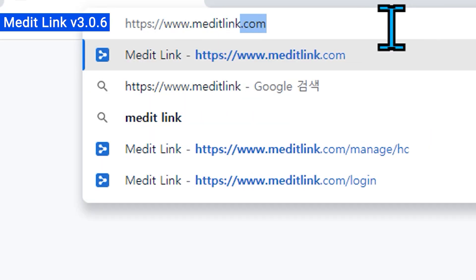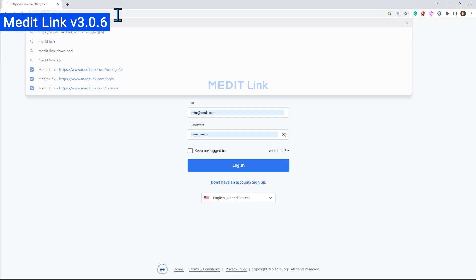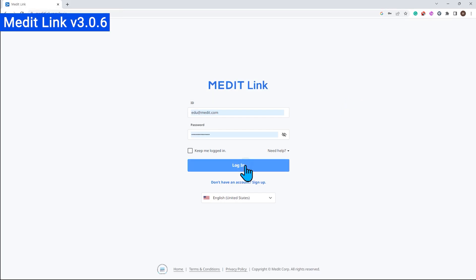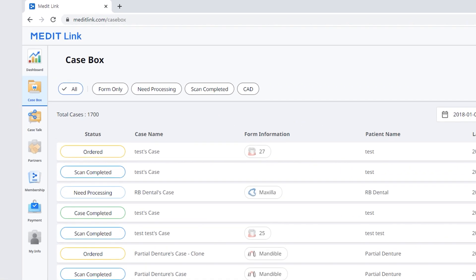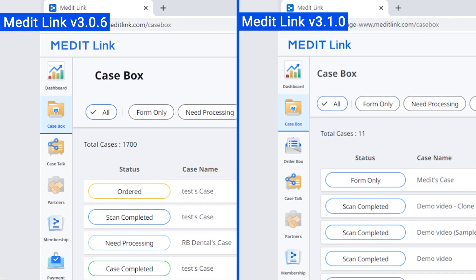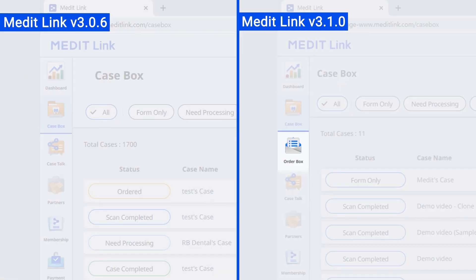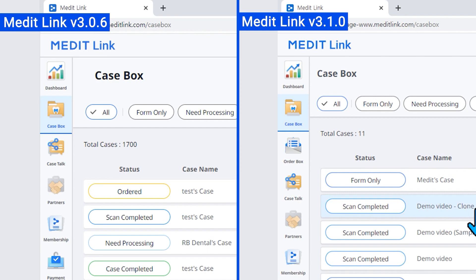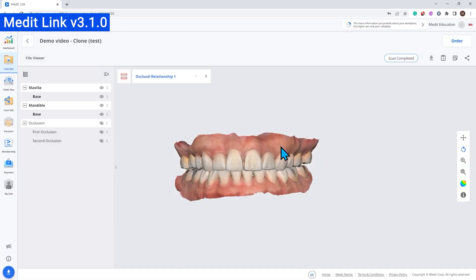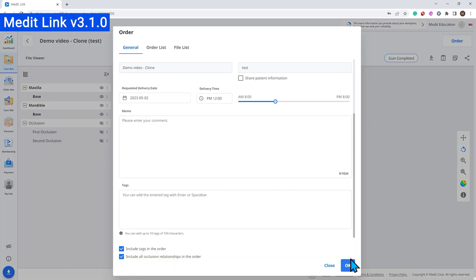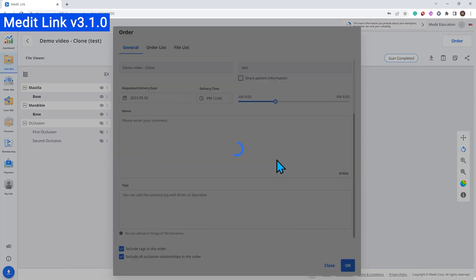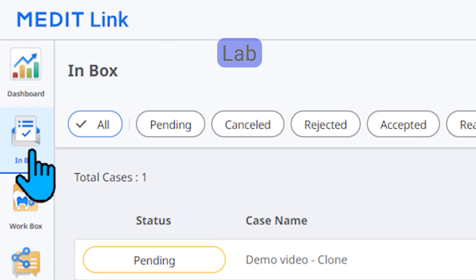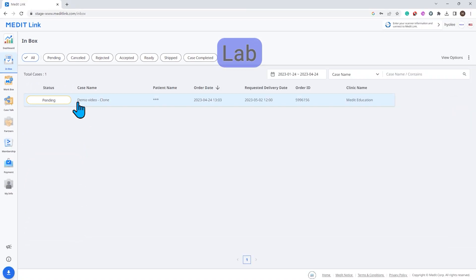Next up, we have our ordering process that is now also available in MeditLink web. Clinics can order and labs can manage incoming orders right on the web.